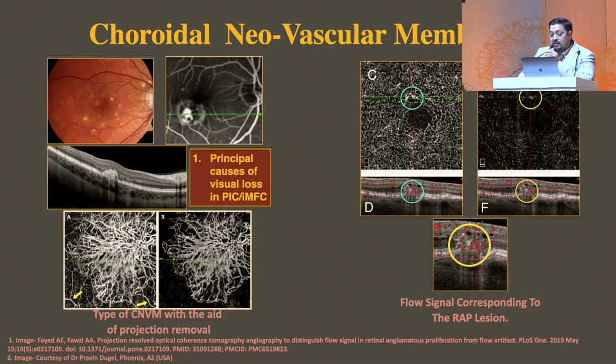As we are aware, in multifocal choroiditis, one third of these patients are associated with a CNVM complex. So again, if you see these whitish lesions, you do an OCT and OCT angio, and in one of the few lesions you see a CNVM complex, which is very well delineated by the OCT angiography. Probably you're looking at a patient of multifocal choroiditis.